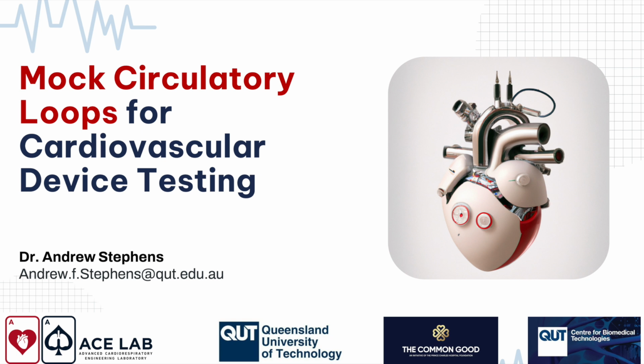And so compliance is really important, because patients with certain diseases have different properties of their compliance, which may make them have stiffer compliance. In some cases, they might have lower compliance. And so it's generally very important to include in a mock loop.